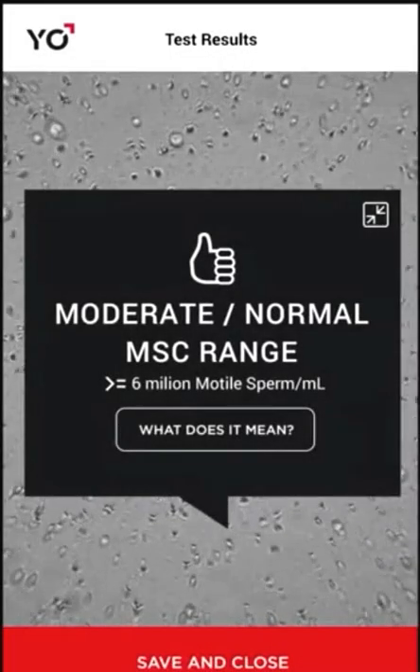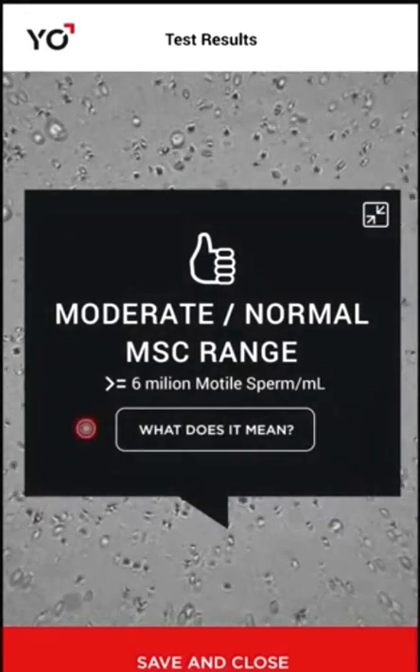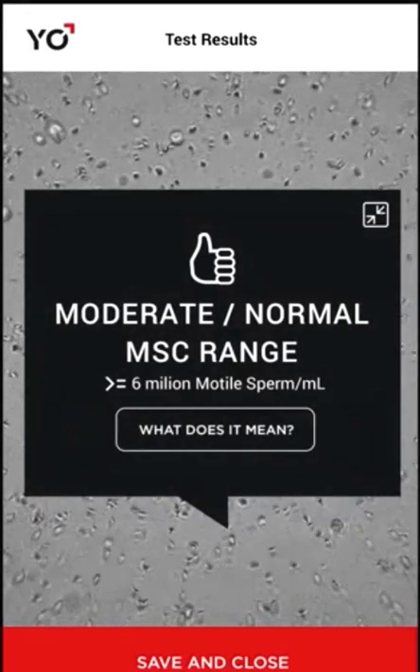Your test results and video are shown in about 2 minutes. To find out more about your test results, tap what does it mean.